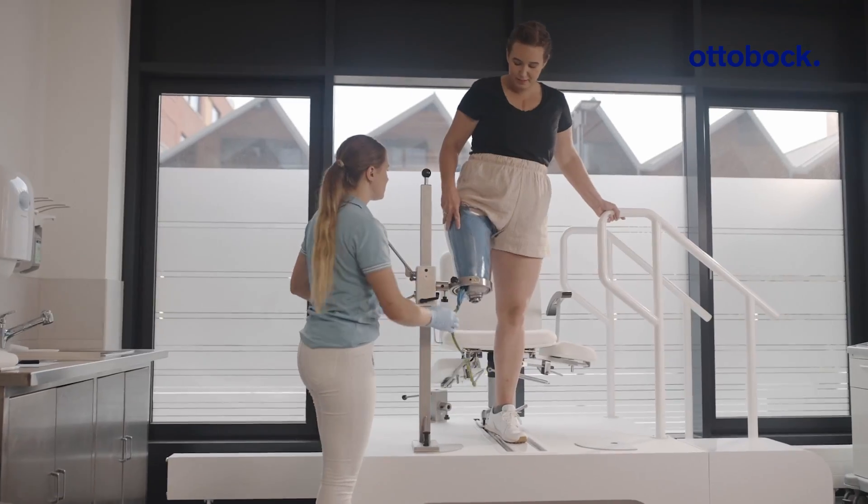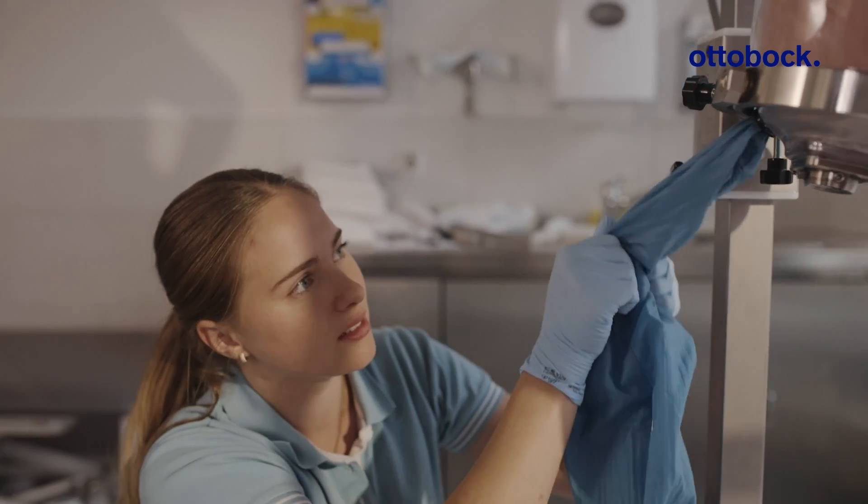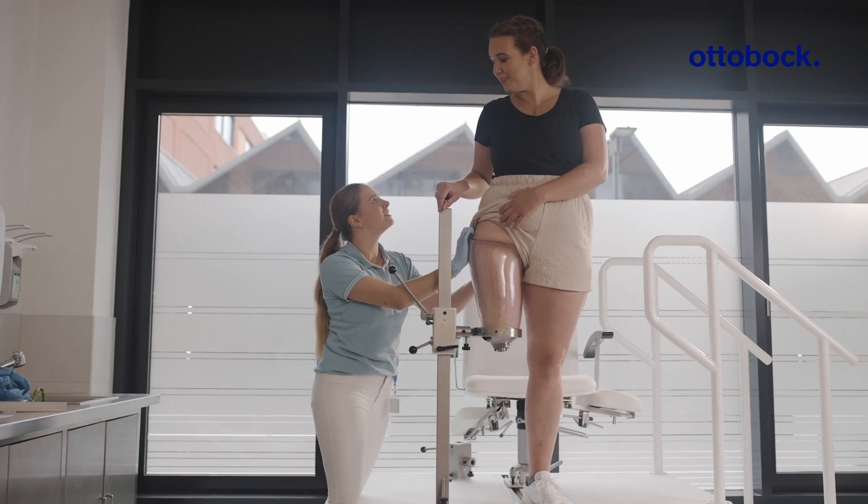With MyFitTF it was very easy to find a socket shape because the measurements were taken. It was already a very good basis for the socket that we could work with.